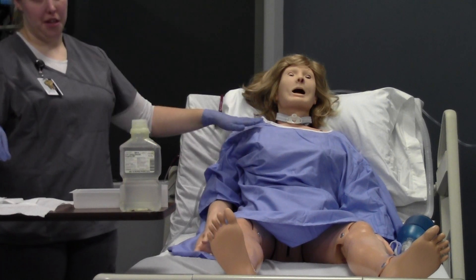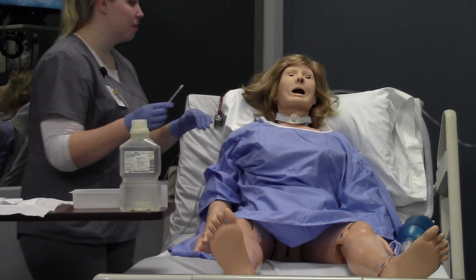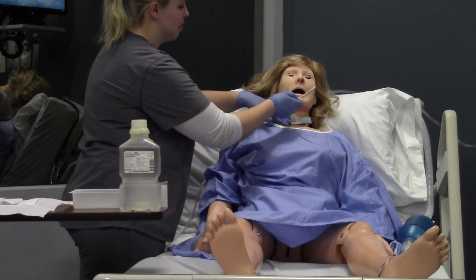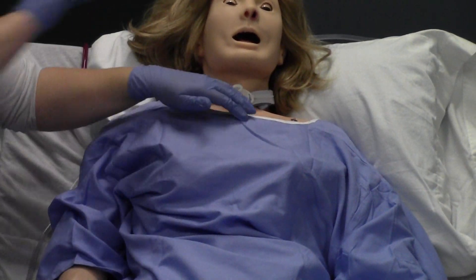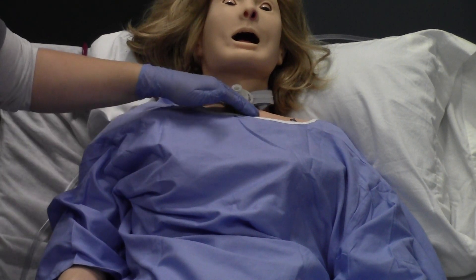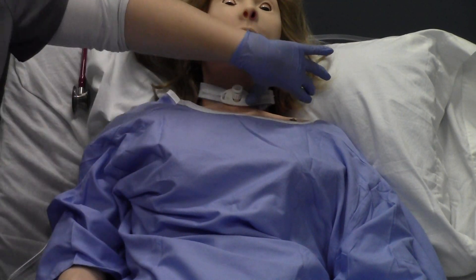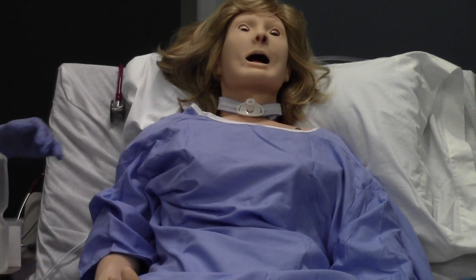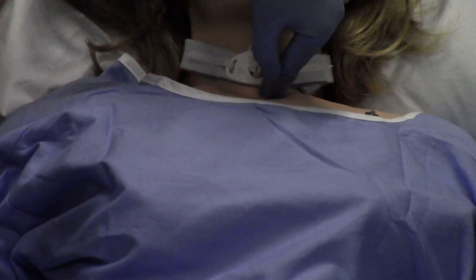I no longer need to be sterile since my inner cannula is locked in place and suctioning is complete. I'm going to get my Q-tips wet. I'm going to support the trach and clean from the top out. I'll split the area into four sections — clean the top first so fluid can run down, then clean the bottom. One swipe, clean, throw away; get it wet, clean the top, throw away; clean underneath, throw away; and again underneath, throw away. You may have five Q-tips — there's just an extra one in case.